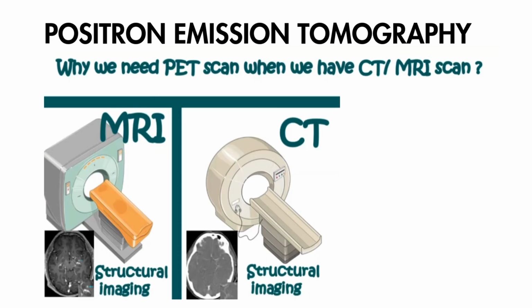Hello all, the topic is going to be positron emission tomography, that is shortly called PET. So first, what we have to understand is that we already have so many imaging modalities, so why is PET required? As you know, we already have MRI and CT, so why do we need PET? That is the question here.